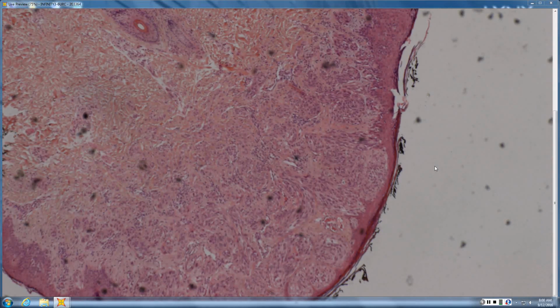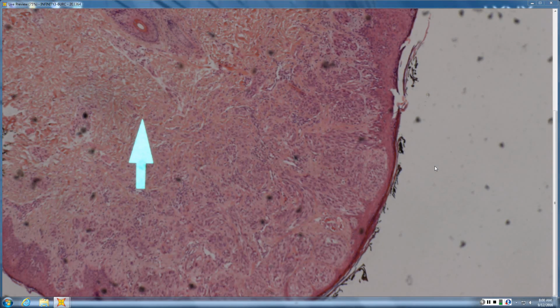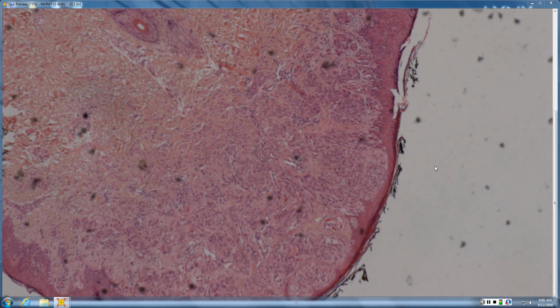So it looks like we have a nodular type proliferation here. It's kind of obscuring the rete. I think it's maturing. They do seem to get smaller, and they do seem to break apart into single cells. If you were to draw a triangle around this, is the point of your triangle more at the top or more at the bottom? I would actually say more at the bottom. Is a point at the bottom a good thing or a bad thing? That's good. Point at the bottom is good. Point at the top is melanoma.